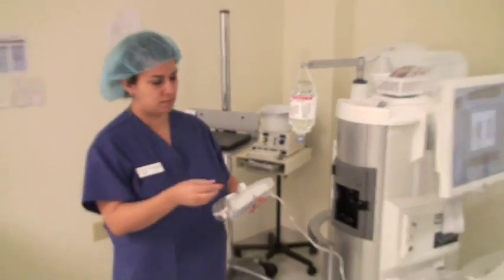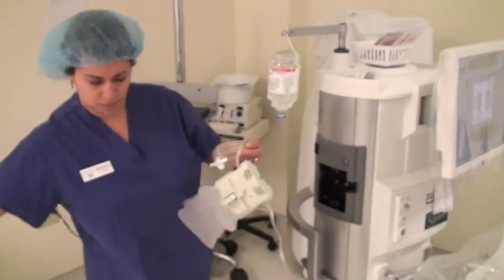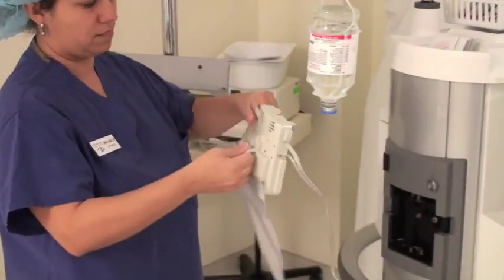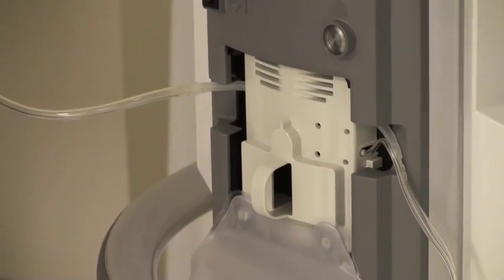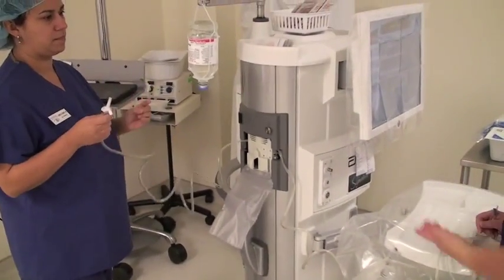Jennifer is opening that, and you just extend the little pocket there — that's going to catch the excess water. Then she's just going to load it into the side of the phaco machine. You just load it in straight, and the machine will grab it on its own. It'll tell you that it's loaded, so you know it's done.